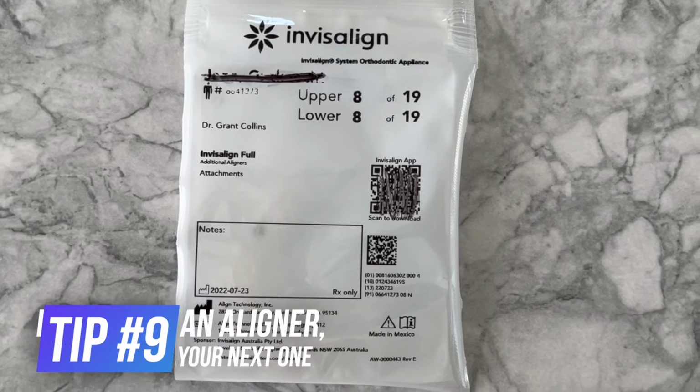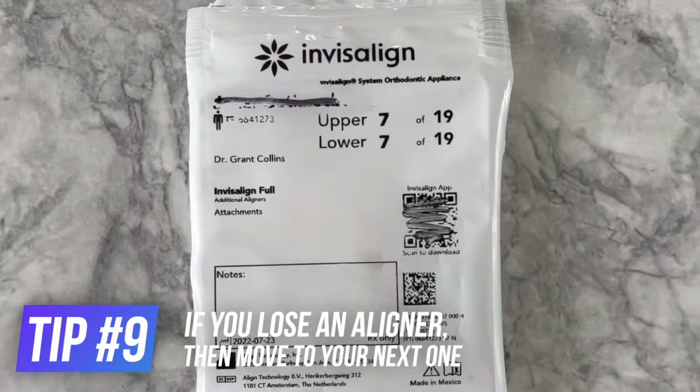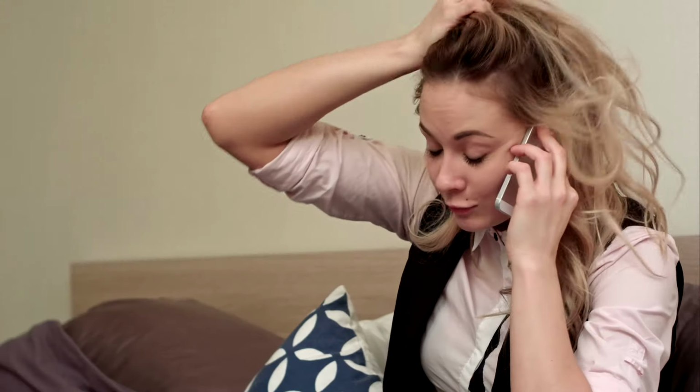So if you lose an aligner, go to the next one or go to the previous one. Just go into something. If you don't have a next aligner, you can always call your orthodontist and they can order a replacement aligner for you to get you into something as soon as possible.